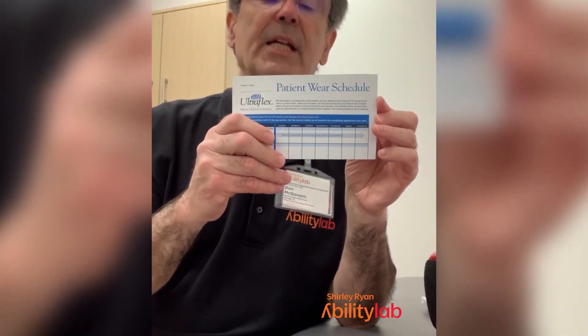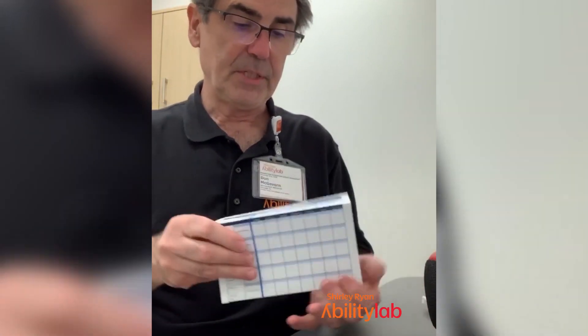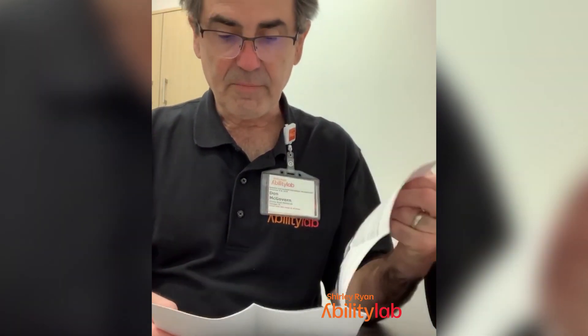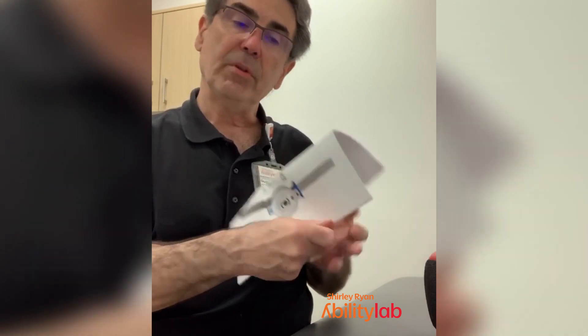With the device, you'll get a little wear schedule which you can mark down if you'd like — keep particular attention to it. If you're the kind of person who likes to do accounting, there are also instructions on how to use the joint. This is more information than you'll probably ever need, but I think giving a person more information is often better. So you can look through this.